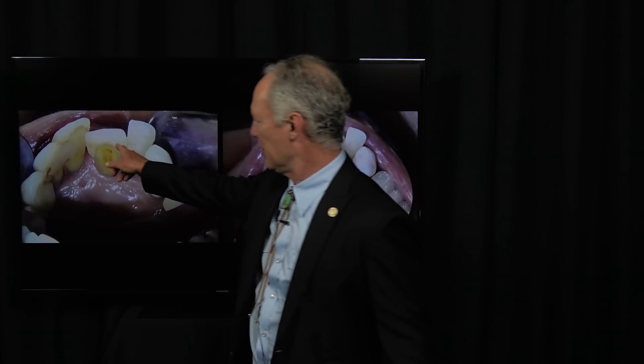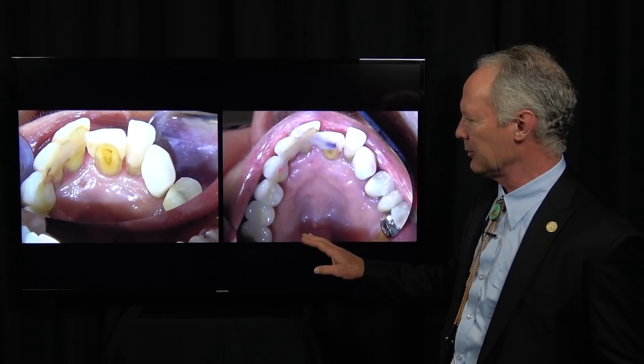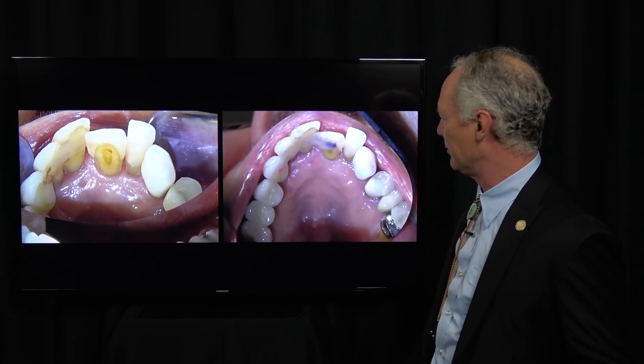These teeth are mobile, and we want to just hold what we've got. It's a very practical stabilizing technique using Ribbond, which is a reinforced strip with bonded composite.